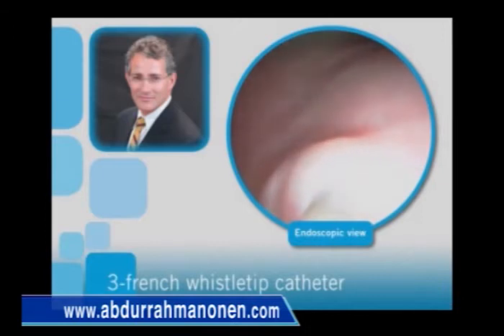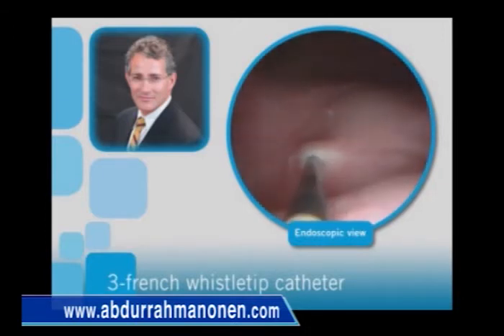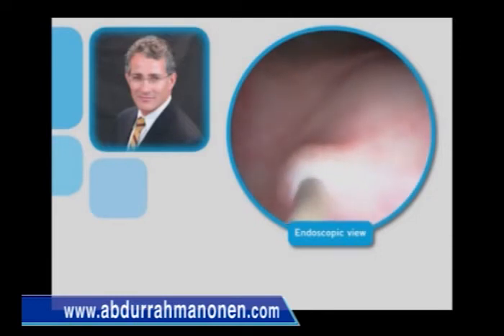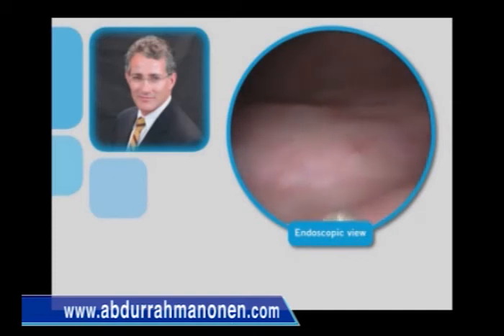Here, a 3 French whistle tip catheter is placed within the upper pole ureteral orifice, as well as the lower pole orifice, showing their close proximity. It would be unusual for treatment of a lower pole to lead to reflux of an upper pole. However, in our experience, we have seen this occur on several instances.